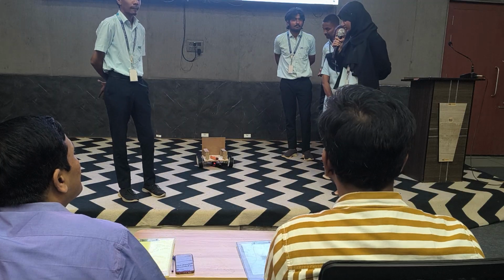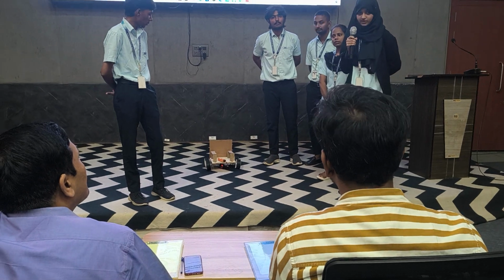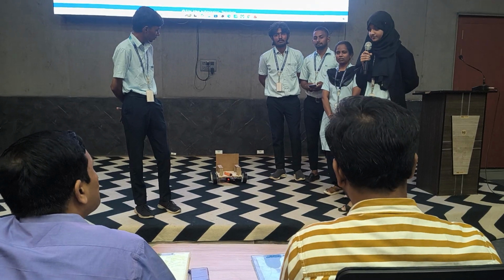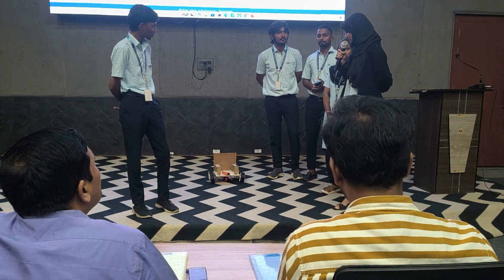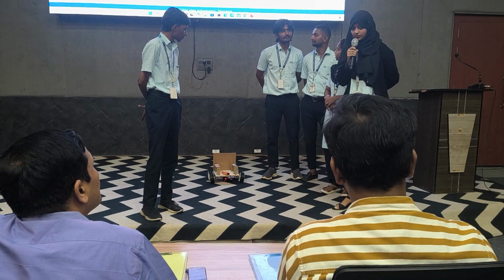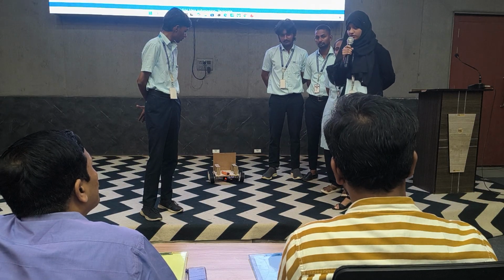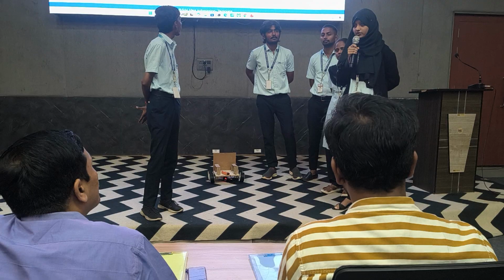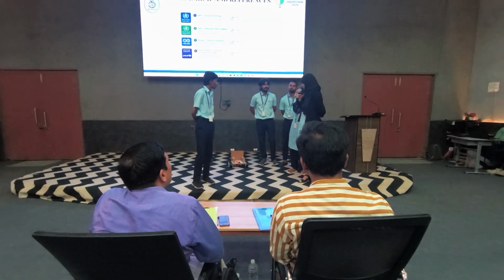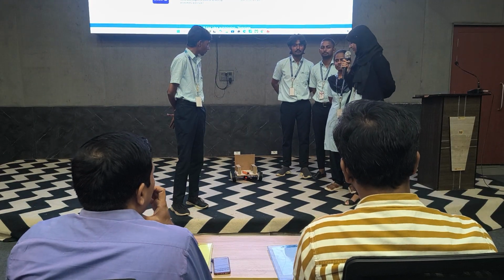As you can see, it is working on joystick. We are further working to make it more workable, and this is just a prototype we have made. In this, we have used a microcontroller battery of 1 hour range. The main battery which we will use in our main project will be rechargeable and last for 5 to 6 hours. It will go at 5 to 10 kilometers speed.